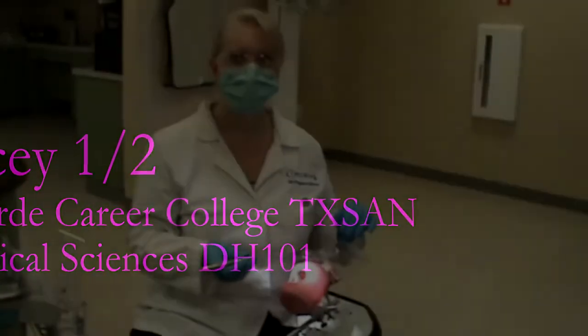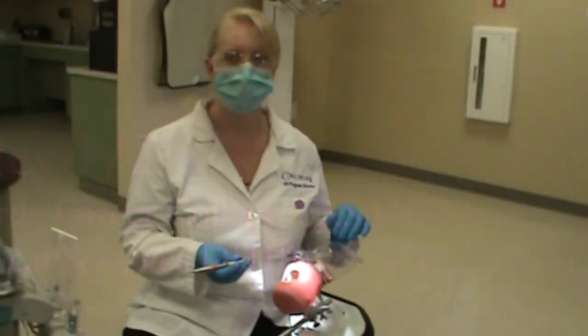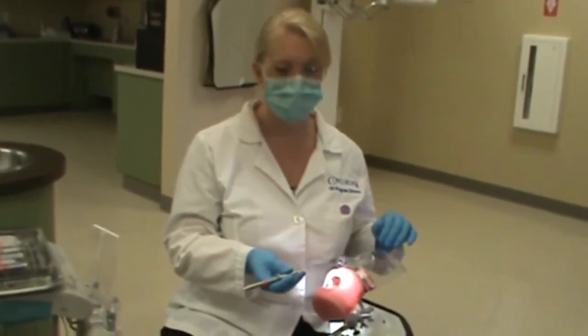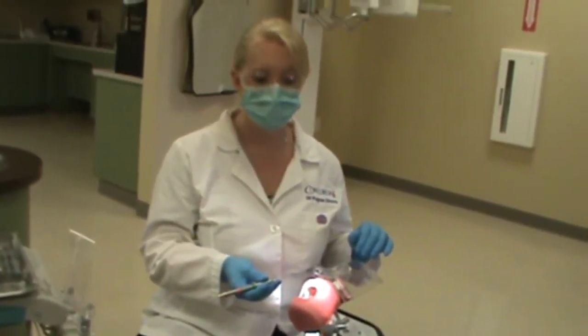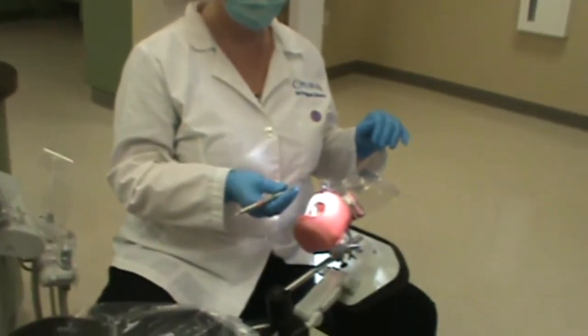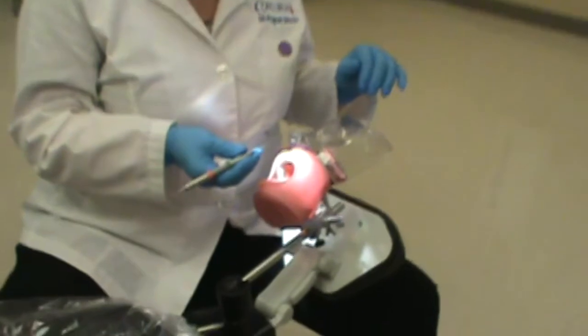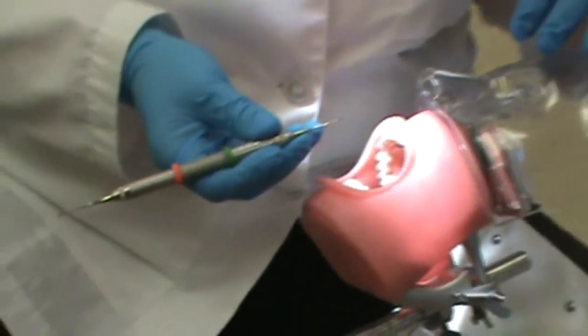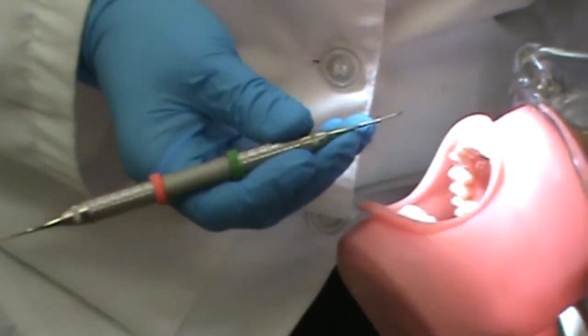Ms. McPhail will be scaling the root surface of number 9 with a Gracey 1-2 area-specific curette. Since she is a right-handed clinician, she will position herself at the 9 o'clock for the surface towards her, or the mesial in this case, and at the 12 o'clock when she is going to scale the distal of number 9, as that would be a surface away from her.